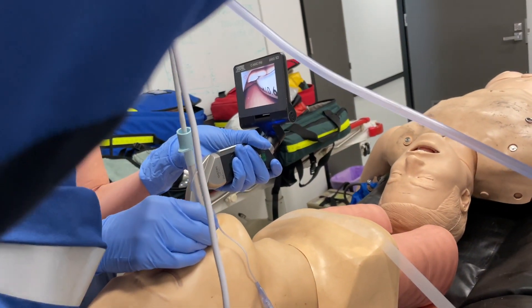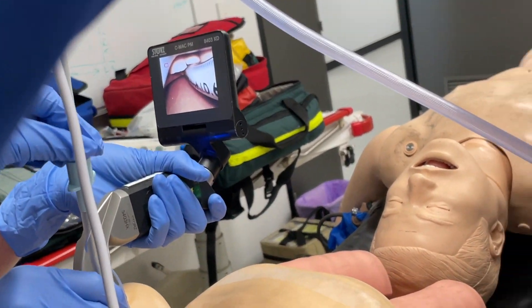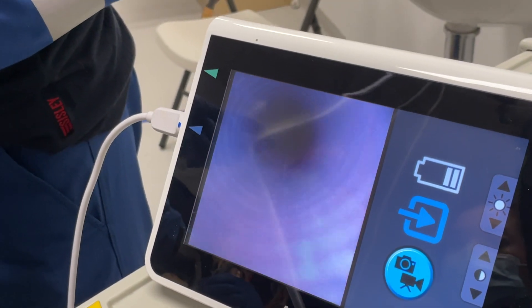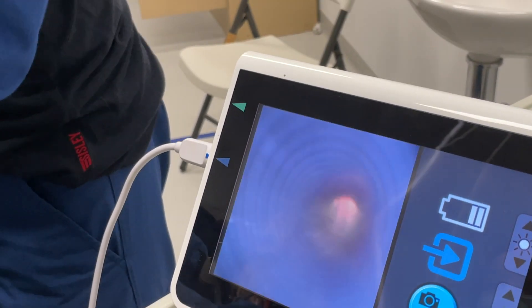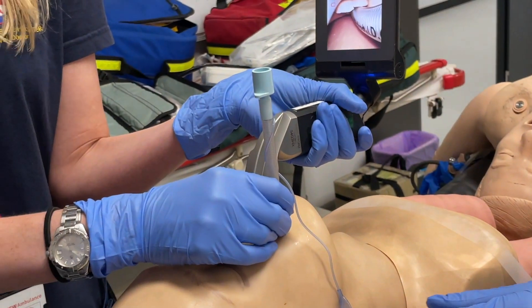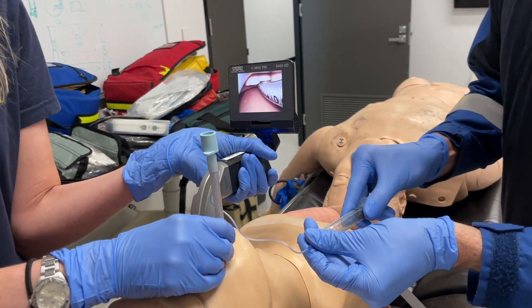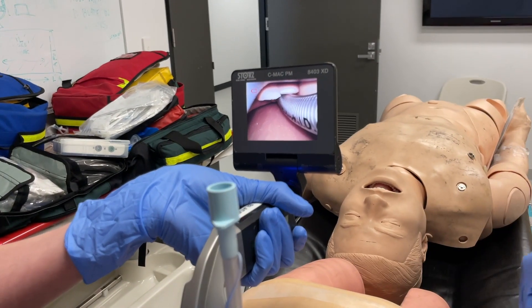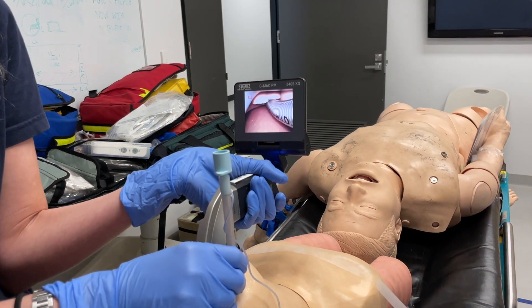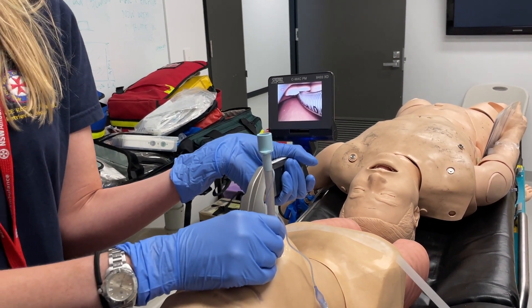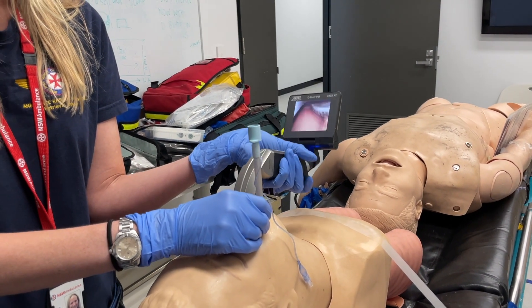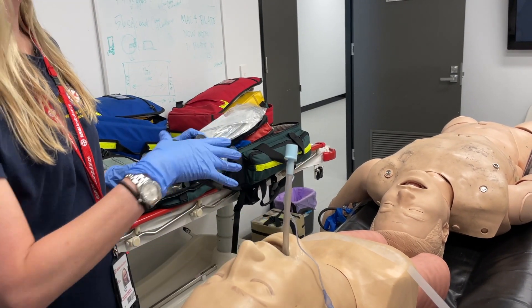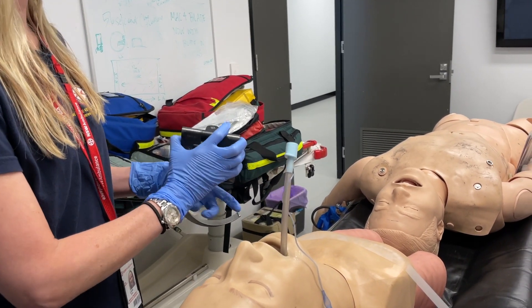We can see the tube enter the airway on the video scope. We then withdraw the flexible scope, coming out through the ET tube. We inflate the tracheal tube cuff, ensure there's no herniation on the video, before connecting our end-tidal CO2 and bagging, then withdrawing the hyper-angulated blade.